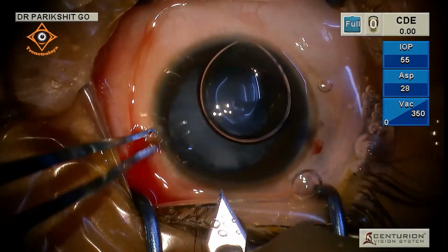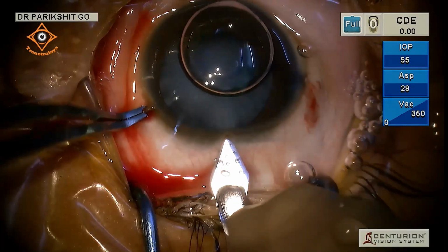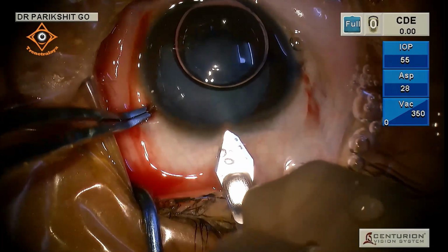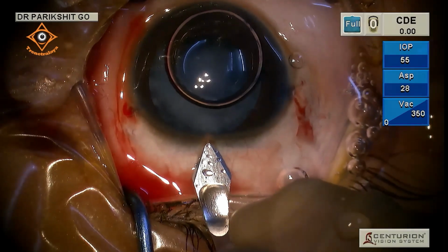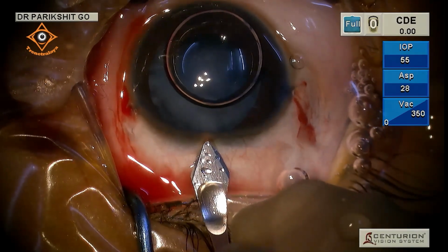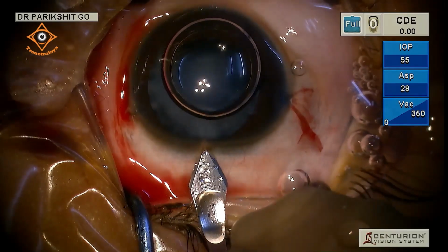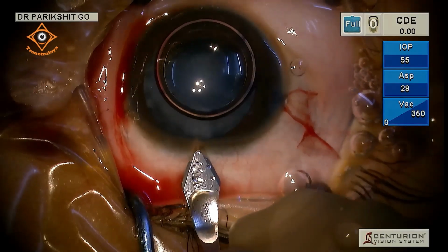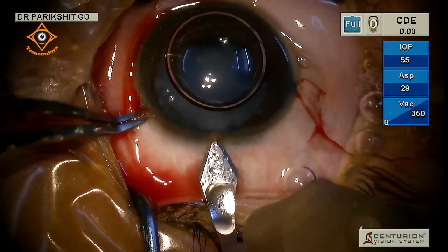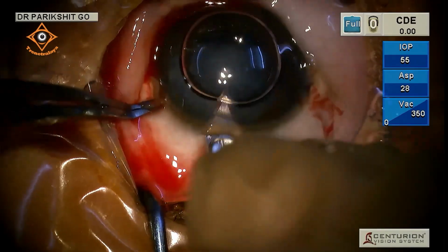What is the viscoelastic that you just injected? This is a high viscosity viscoelastic. What is the name of that high viscosity? What is the visco we have used? Tell it, there's no issue about it. There are no legal people here. Healon GV, was it? No, we have used HPMC only. Viscoat we have used, sir. HPMC, sir.